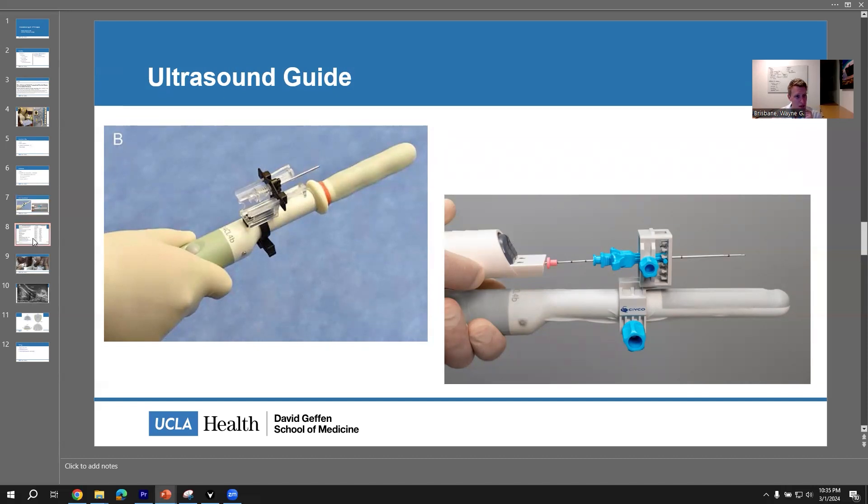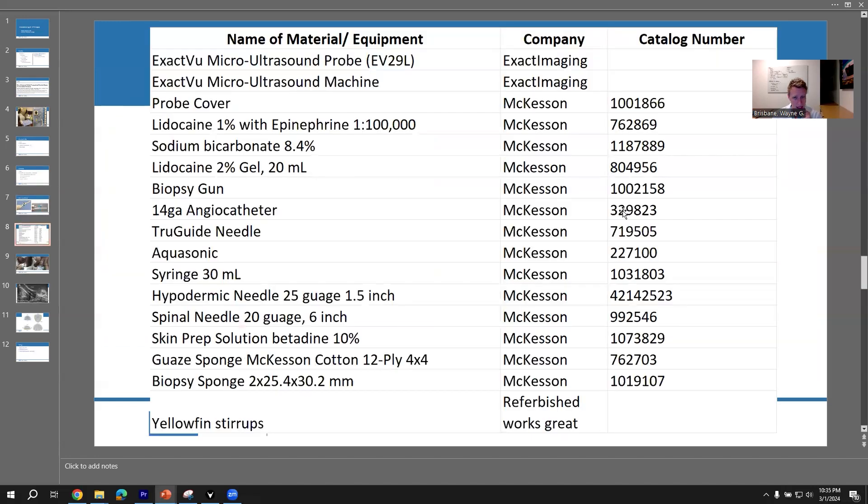These are the equipment that I have been using. I'll leave that up for a second so you can take a photograph because I put the McKesson number in — these are the catalog numbers for all of these different things. To run through them quickly: ExactVue — that's what I use, but you can use whatever you need. The probe cover — pretty simple stuff. The lidocaine and sodium bicarb to mix them, about nine mils of lidocaine to one mil of bicarb.